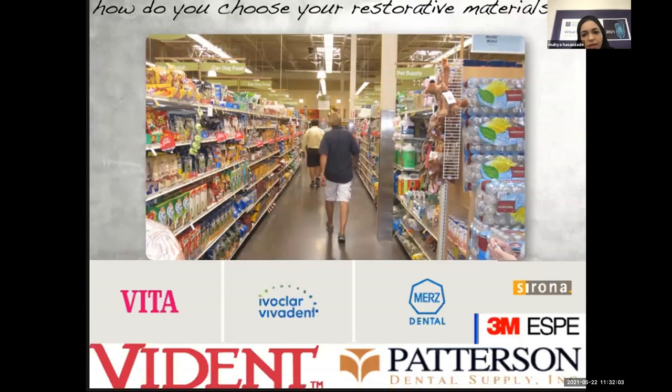The selection is seldom made on the basis of a true understanding of the material's characteristics, and actually more often it's based on criteria such as the strength measured in in vitro studies, degree of translucency, manufacturing technique, the preference of our technician, or even the advertising of the product claims.